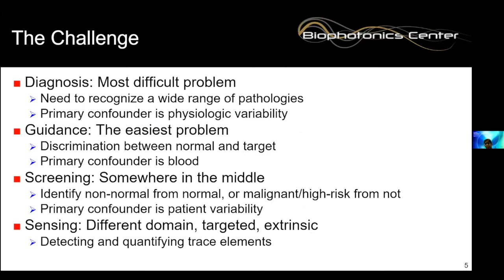But when we talk about clinically, you heard a lot about surgical guidance, but there's various aspects of evaluating tissues, especially when you're trying to do things clinical. You can do diagnosis, which I think is probably the most difficult problem. And historically, a lot of these techniques are primarily used for diagnosis of optical biopsy. That's probably a phrase many of you have heard.